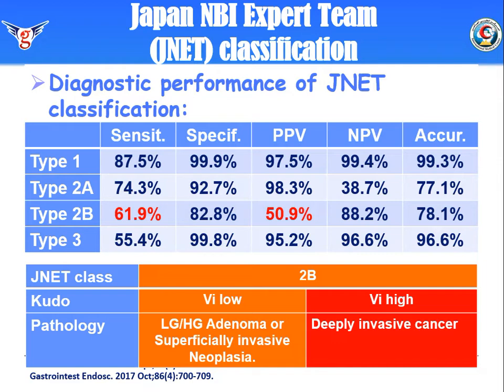That led some to recommend using a contrast agent to define the pit pattern before resection in that type. And if it is 5I, low-grade pit pattern, resect. And if 5I, high-grade, do not.